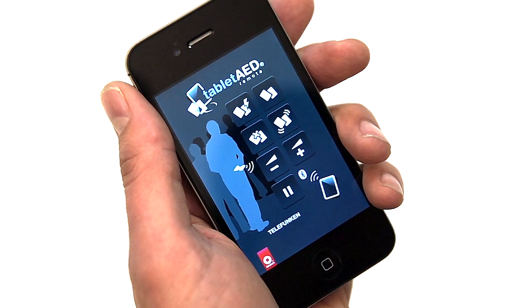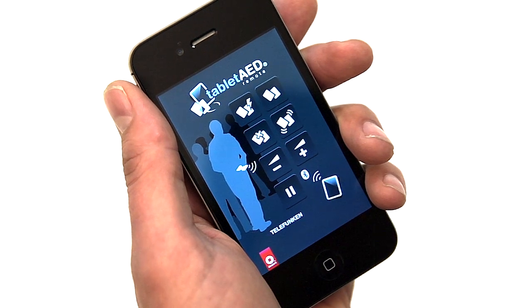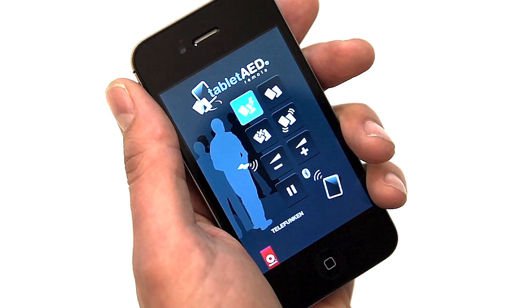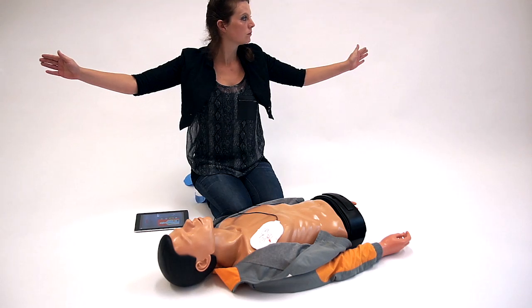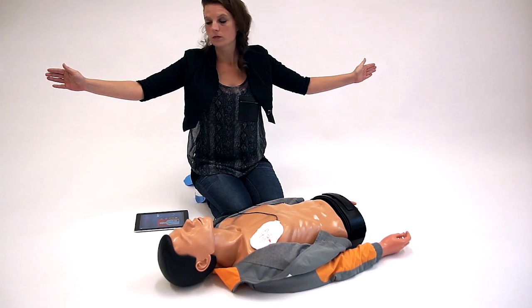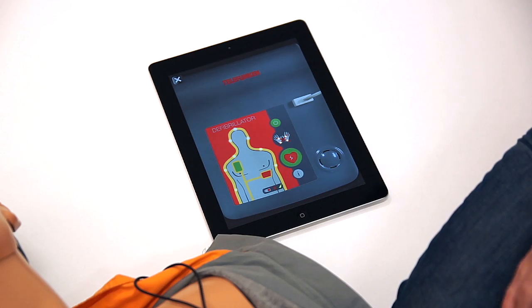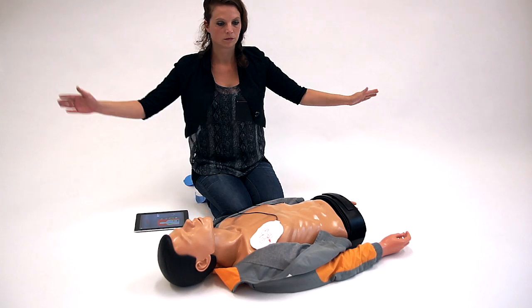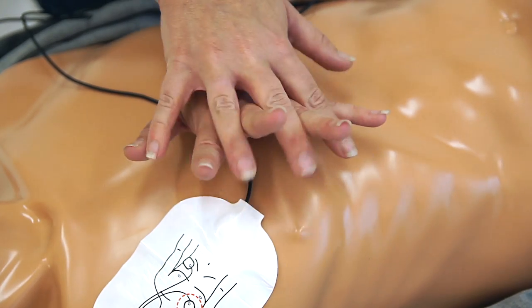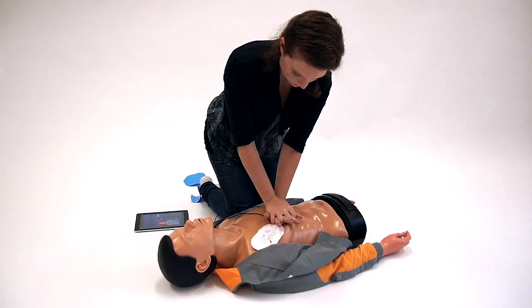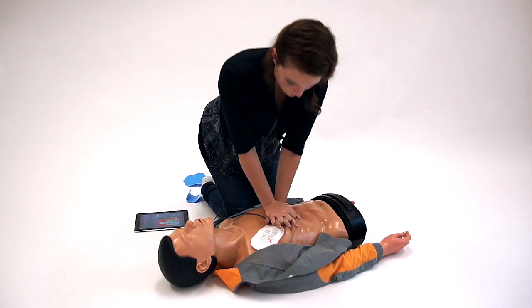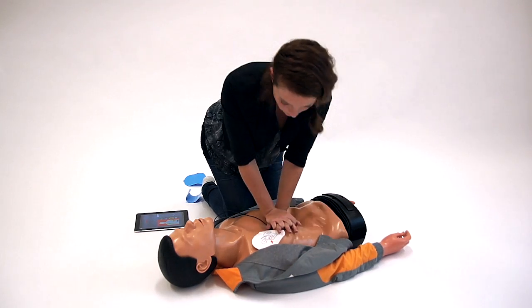The Tablet AED Remote app sends commands to the Tablet AED Trainer app to simulate a training scenario. Press the flashing shock button. Shock has been given. Patient may be touched. Carry on resuscitation — alternately give 30 chest compressions and 2 mouth-to-mouth breaths.